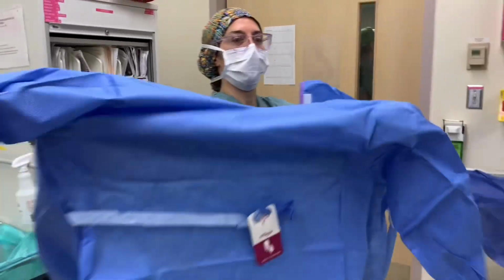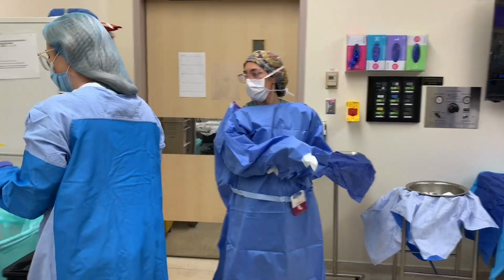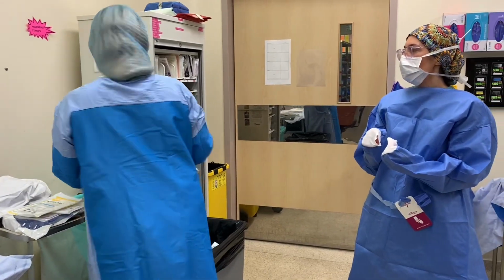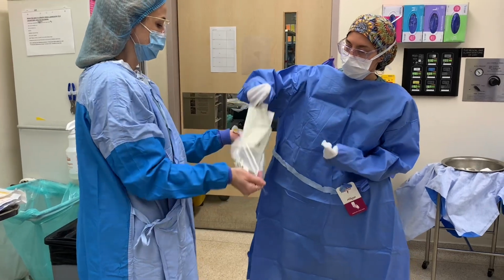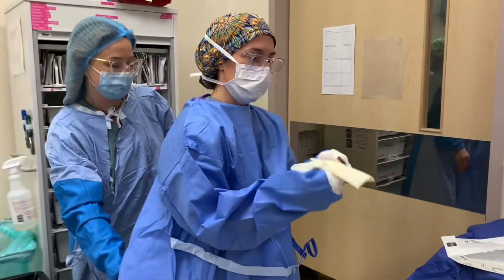Typically, the circulating nurses do often end up opening many items for the scrub by finishing off their opening and telling them to go scrub. So instead of doing all the circulating duties first, it is suggested to break down the circulating tasks into smaller tasks and focusing on opening for the scrub sooner than later, allowing yourself some time to complete circulating tasks while the scrub nurse is then setting up.